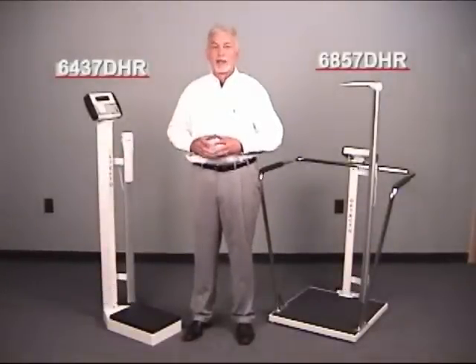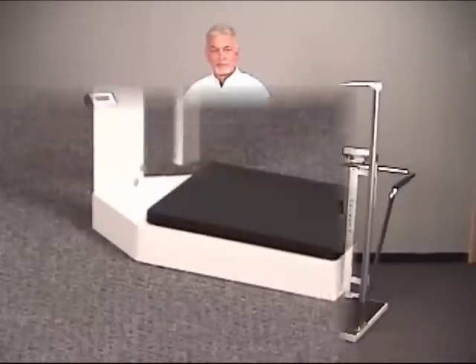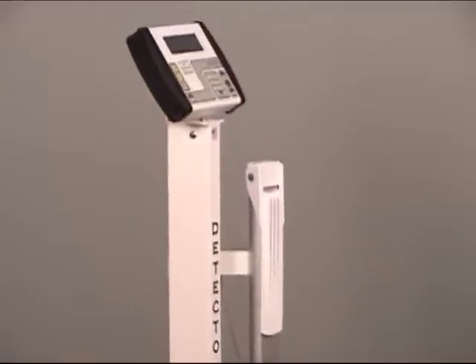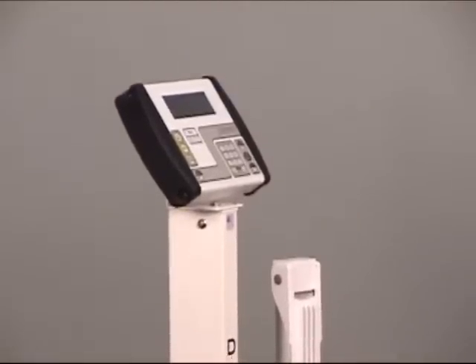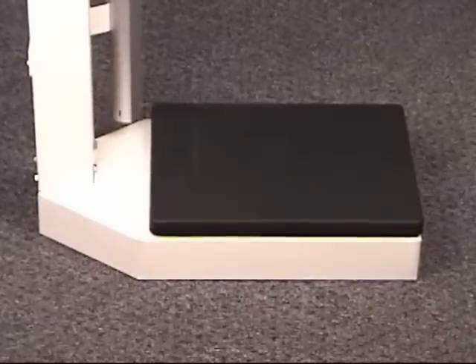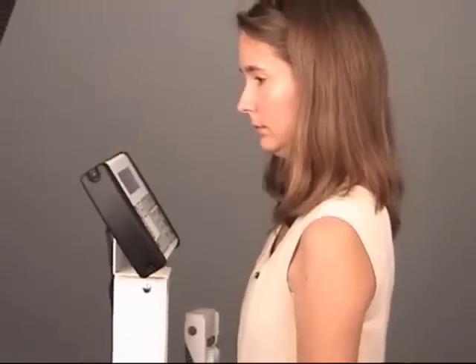Now let's take another look at the Detecto 6437 DHR. Detecto physician scales incorporate all-steel construction and a superior paint finish to provide you years of service for high-volume patient weighing in the clinic or hospital facility. With the comfort of eye-level viewing and the robust 500-pound, 225 kg capacity scale base, the 6437 DHR is the quality you expect for your investment.